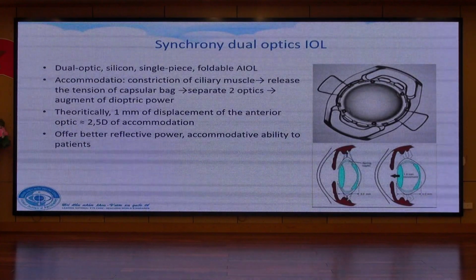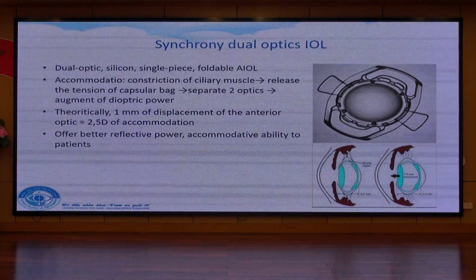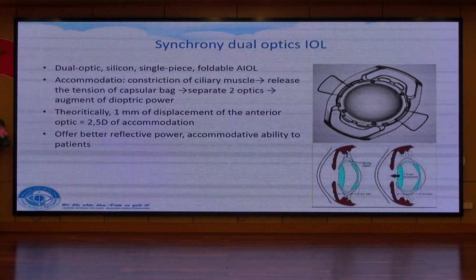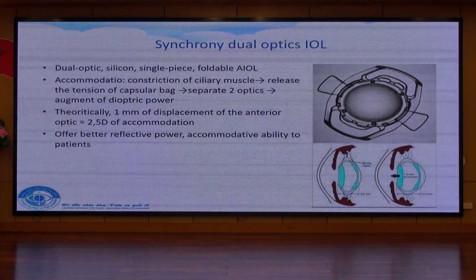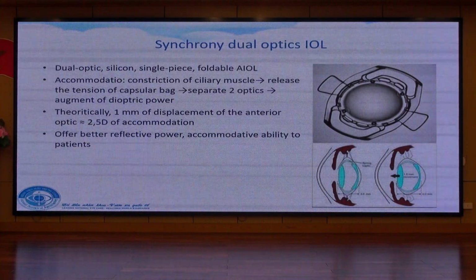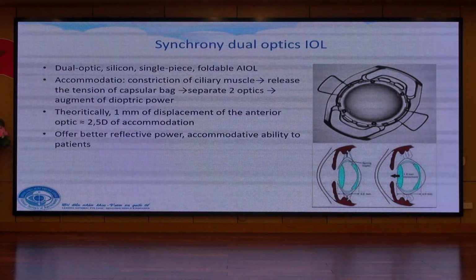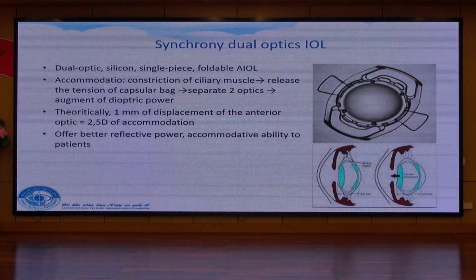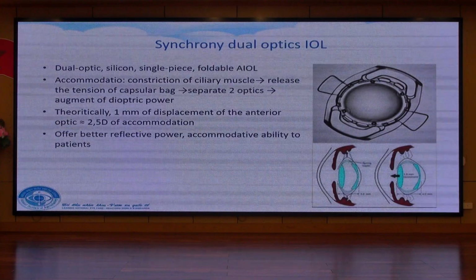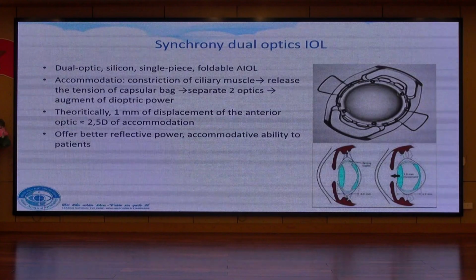The first one is the Synchrony dual optic IOL. It is a dual optic silicone, single piece, foldable AIOL. When accommodation occurs, the ciliary muscle contracts, releasing the tension on the capsular bag, and then the two optics separate, resulting in augmentation of dioptric power.